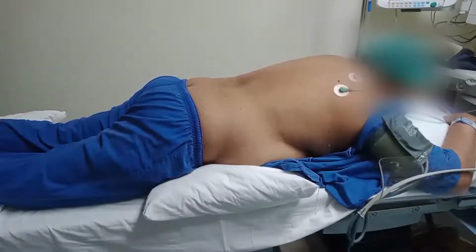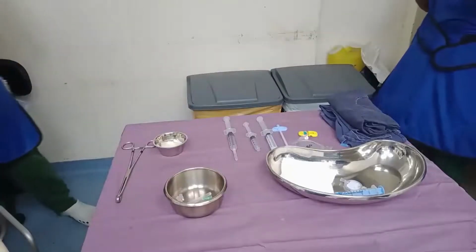For this procedure, we require the patient in prone position. It is an uncomfortable position, so the patient may require sedation for more cooperation in the procedure position. We need a pillow placed under the abdomen, and the purpose of this pillow is to have full flexion of the lumbar spine. That helps in case the caudal epidural is not successful, then we can go on to an alternative procedure of interlaminar epidural.